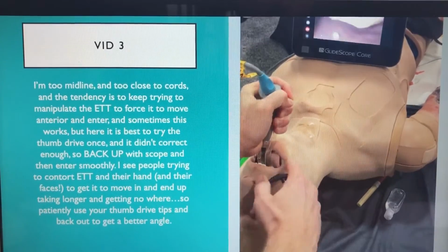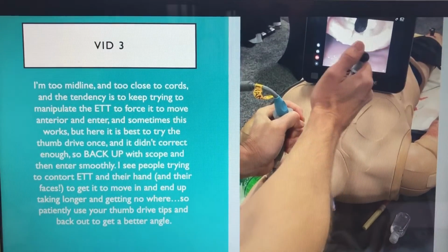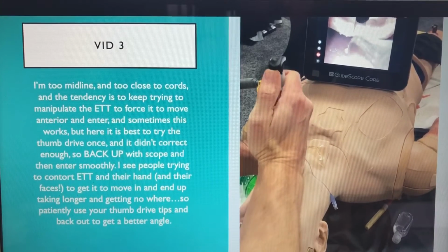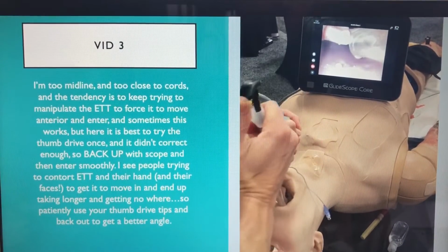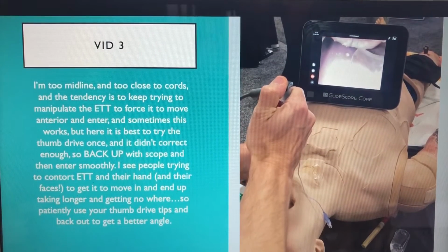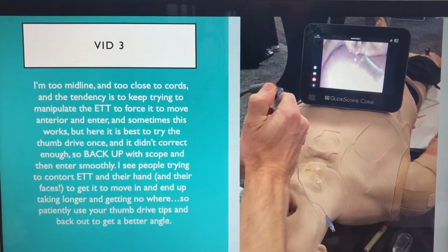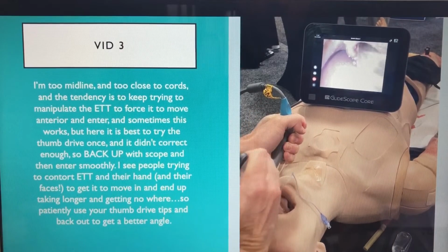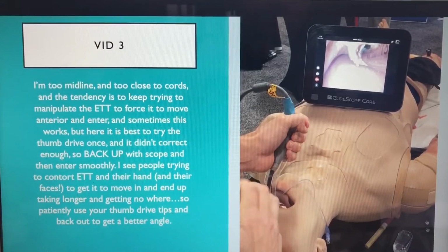So watch this video. See, I'm stuck on the posterior. I can lift my thumb up, and that's going to lift the tip of the tube up, and it still wasn't enough. Trying to move it, it's not going forward, so I back up some, reposition the scope, and the tube goes right in. And you're going to find that that works very frequently if you do it that way.